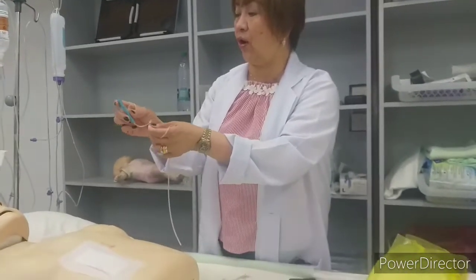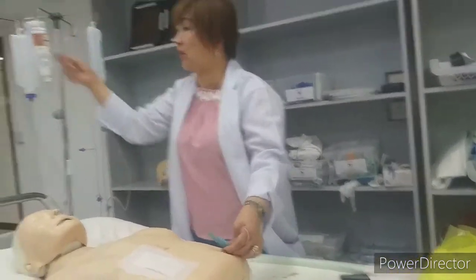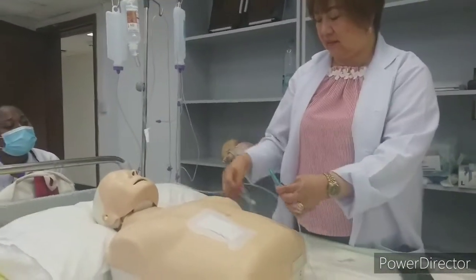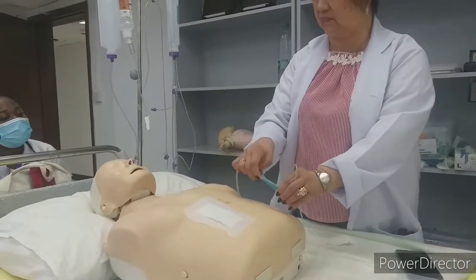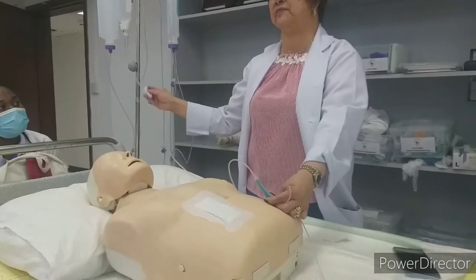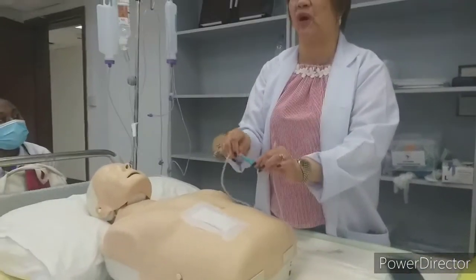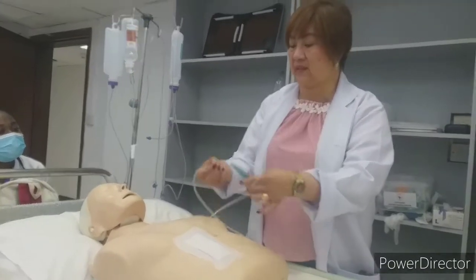Open the other side, that is for your medicine. Same way. Get a gauze and pinch open, then connect, then same way with your NGT feeding. So flush before you feed, before and after. The same way, pinch open.